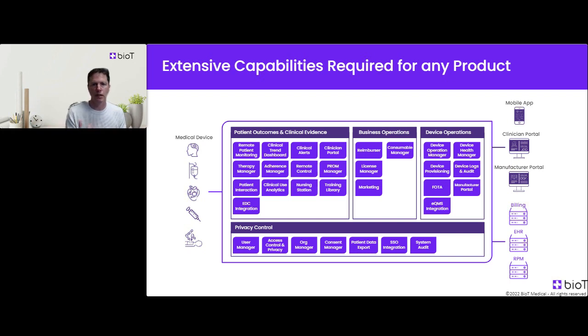You don't know anything about them unless you monitor them, monitor their health, monitor the quality, by the way, that they send data that is within the ranges that are acceptable. I don't know if you are familiar with the term technovigilance. Now regulations are coming more and more strict on that.